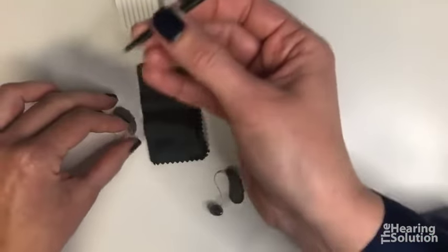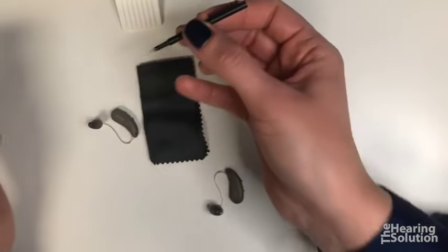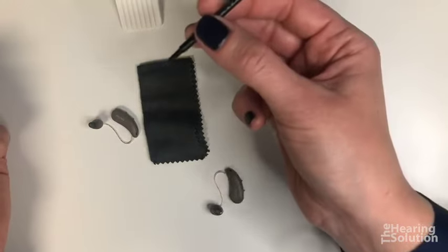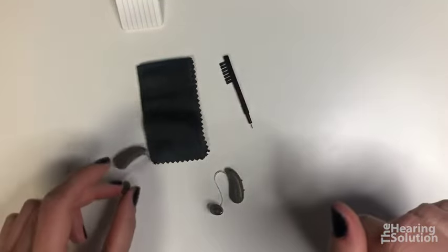On the brush, you'll see a little wire loop on one side. That's actually for a different style of hearing aid, so you won't need to worry about that loop. And that is how you clean your Signia hearing aids.